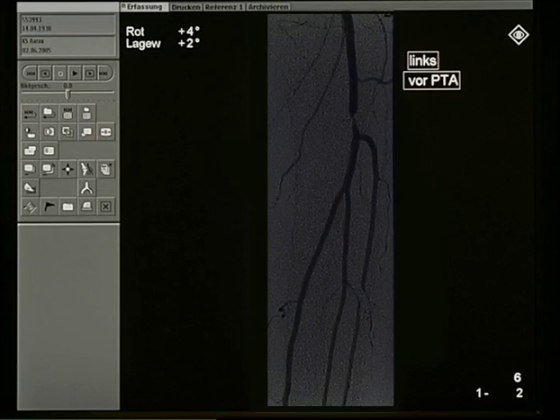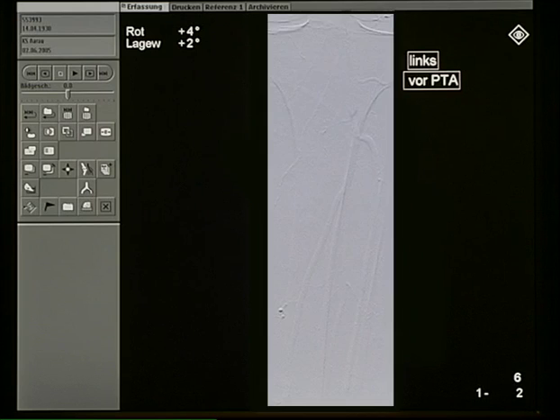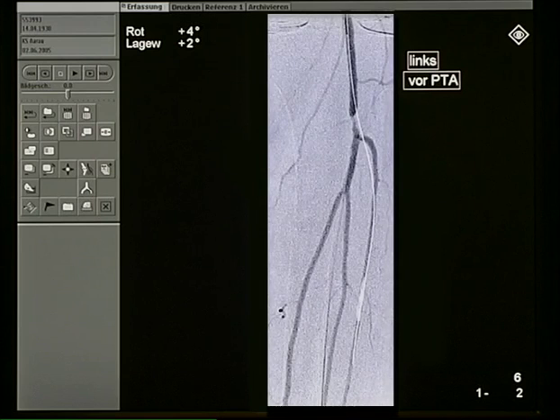In the road mapping technique, the last image hold X-ray is used as a mask during the first fluoroscopic cycle with contrast injection. Vessels filled with contrast agent appear dark. Before the next fluoroscopic cycle, this mask is removed from the actual X-ray image so that the guide wire or the catheter can be visualized and tracked. Road mapping helps the examiner to work more efficiently and, above all, to minimize doses of radiation.